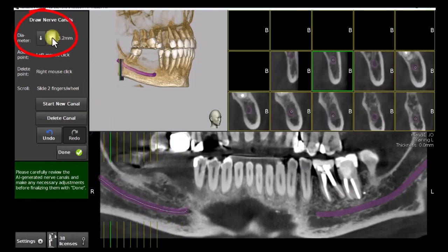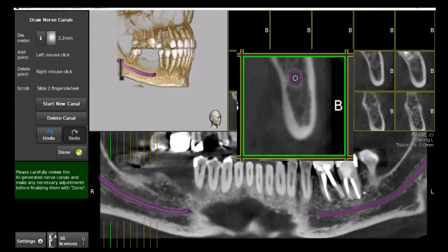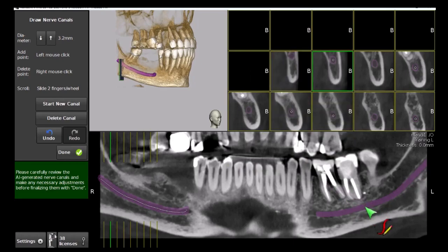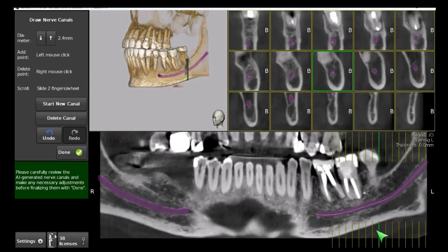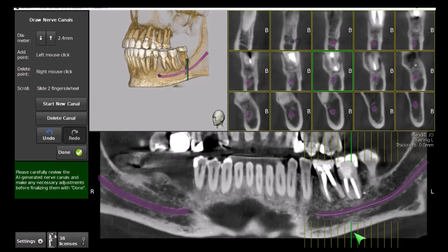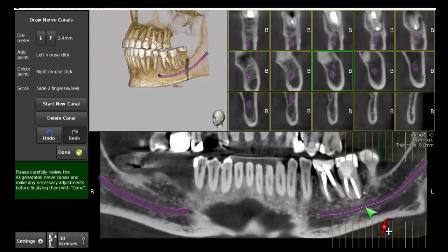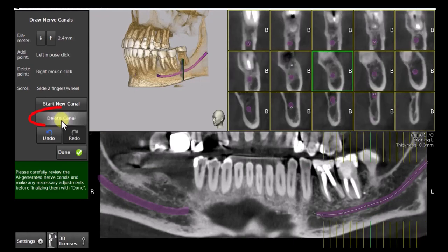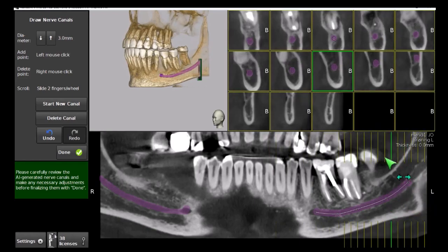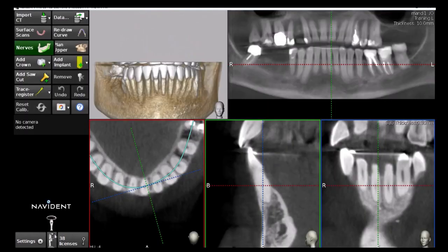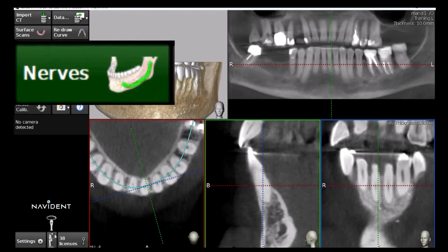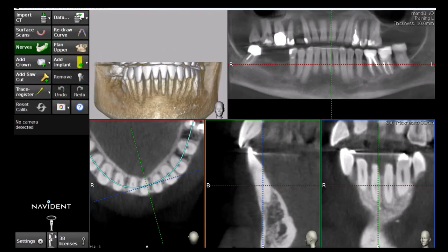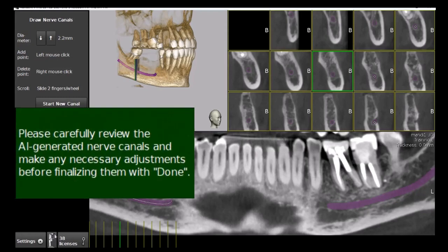For safety reasons, it is important to make sure that the whole circumference of the canal is covered by the marking. Switching between marked canals is done by left-clicking on the canal, which then becomes editable. A marked nerve canal can be deleted in whole by selecting it and clicking Delete Canal, then manually redrawn if needed. If both nerve canals are deleted, they will be automatically marked by the AI process the next time the CBCT is loaded in Navident, and the user will be asked to confirm the marking for safety purposes.